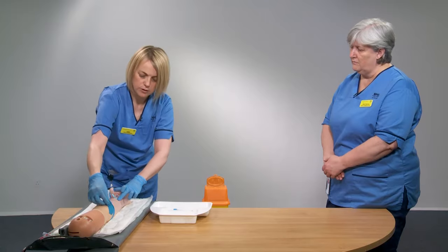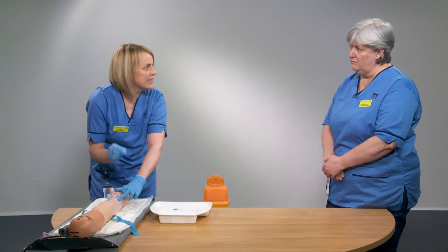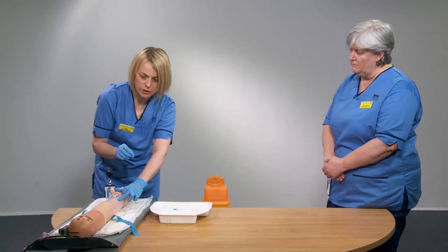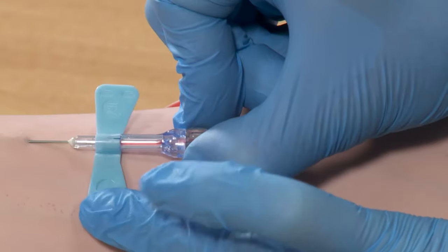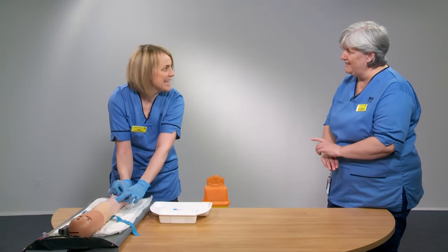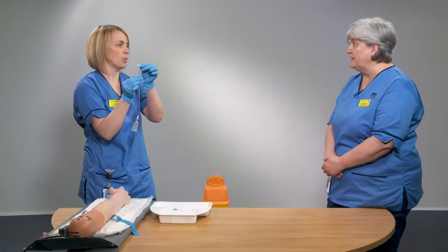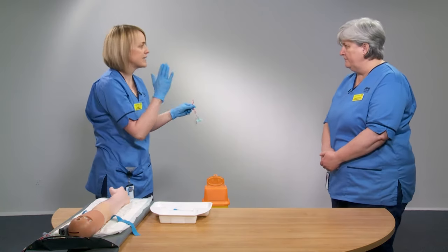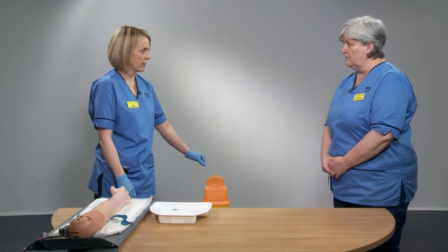When ready to remove the needle, first remove the tourniquet — this can be done with one hand. Before withdrawing the needle, activate the safety device. On the butterfly, the needle retractor is positioned below the wings: pinch and pull back until the needle is completely retracted. You'll hear a click, confirming it's locked and won't slide forward again. Then go straight skin to bin — directly into the sharps bin — to reduce needle stick injury risk.